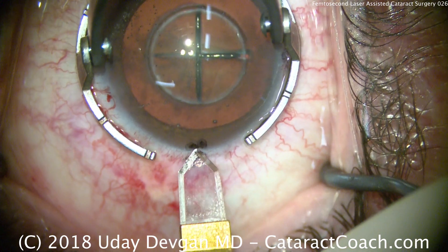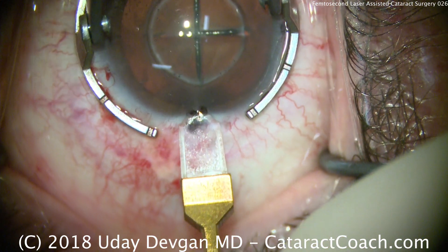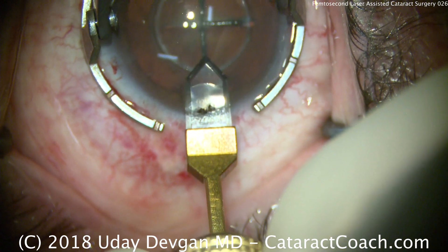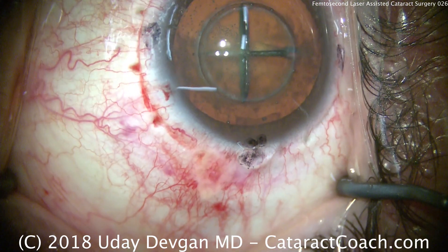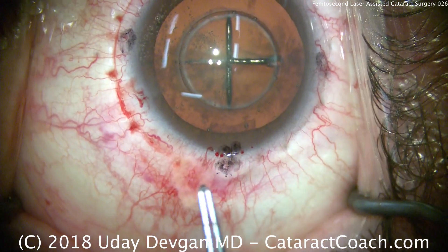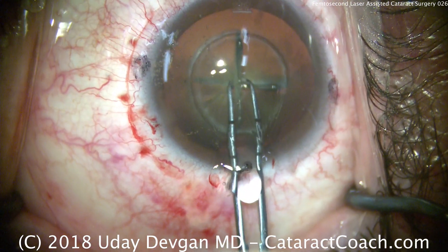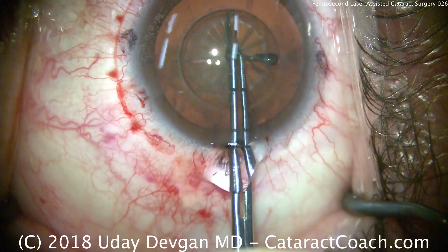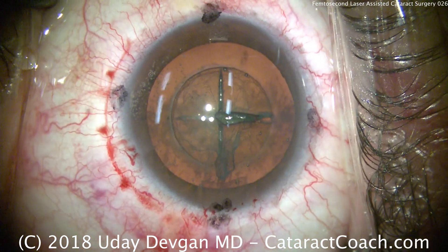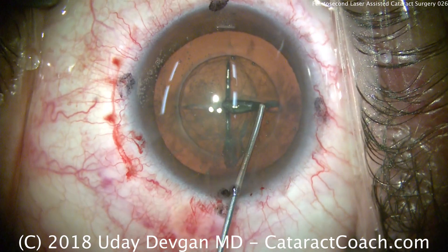The femtosecond laser has created a very precise, five-millimeter capsulotomy, and it's centered very well on the patient's visual axis. Now that the incision is made, we enter the eye with capsule forceps, simply lift up and pinch that central capsulotomy, and remove it. We'll then proceed with hydrodissection using balanced salt solution on a blunt cannula.